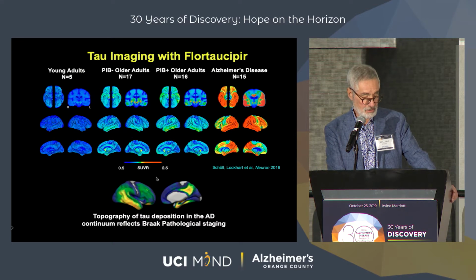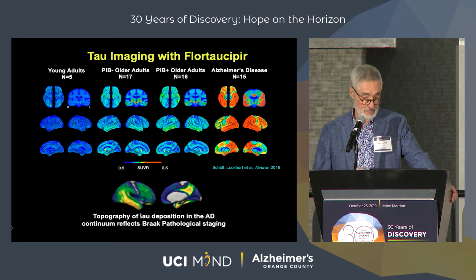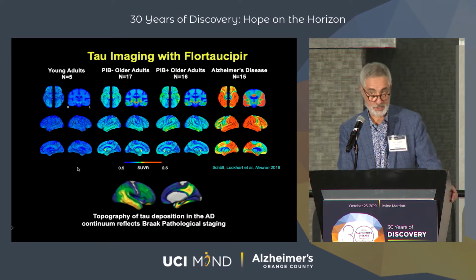And I think you can remember back to those scans I showed you of the glucose metabolism and the cortical thinning, and it tends to be fairly well paralleled with where the brain is shrinking and where glucose metabolism is going down. So I just want to say one more thing about Alzheimer pathology and normals.